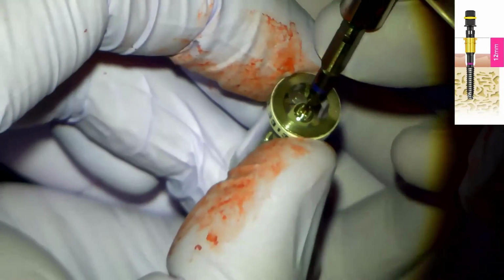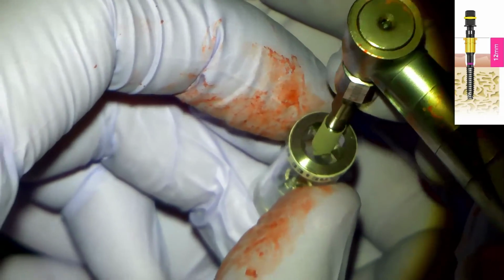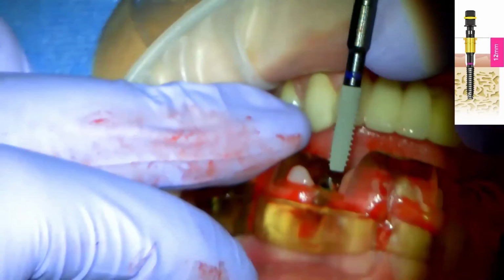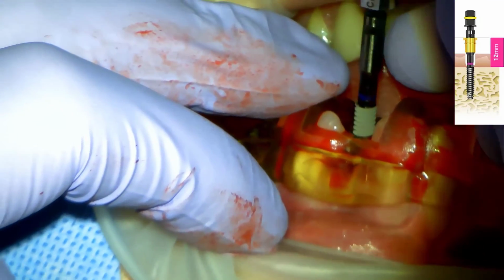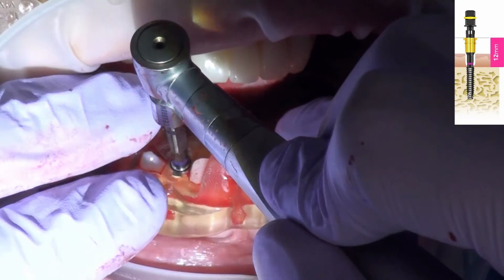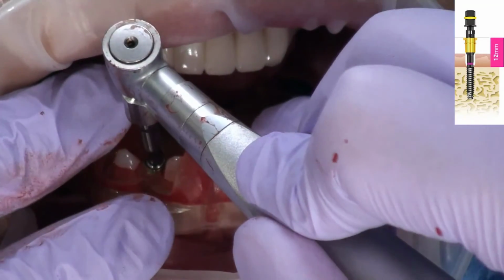I'm going to go ahead and take our implant. There's our implant. My motor now is at 30 RPMs, 35 of torque. Real big for me. I'm going to push this as far down as it will go. That's about it. And again, bottom of this black line is going to be my stopping point.